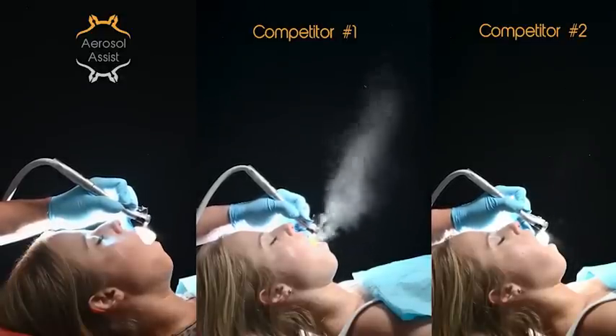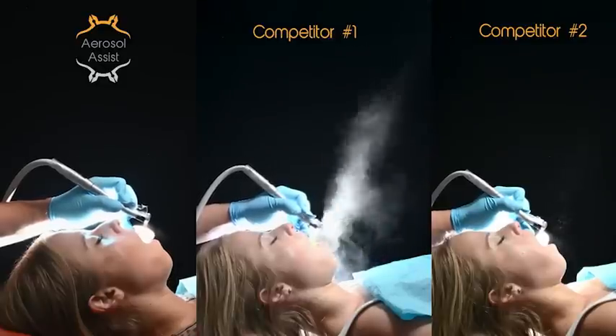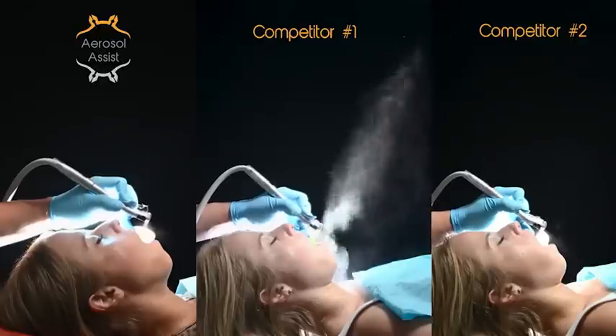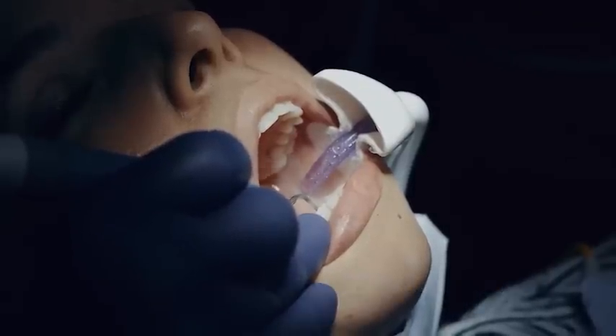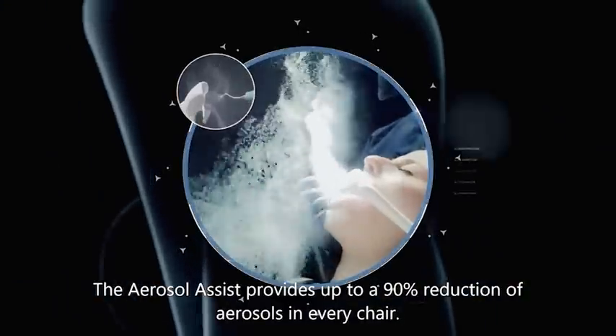You will benefit from the aerosol assist from the first time you try it. However, we recommend using it multiple times with different procedures to have a better understanding of how it works in different scenarios. It is a tool that can be learned easily, and once you see its benefit, you will want to have it in your armamentarium. The aerosol assist is the only system to simultaneously remove aerosols and intraoral fluids in one hands-free device.